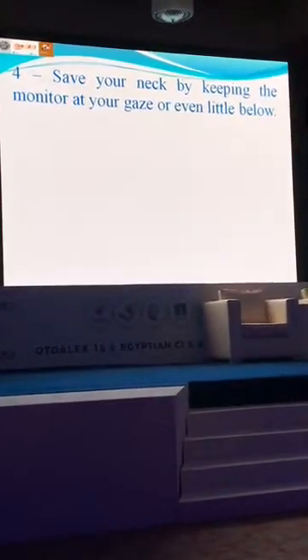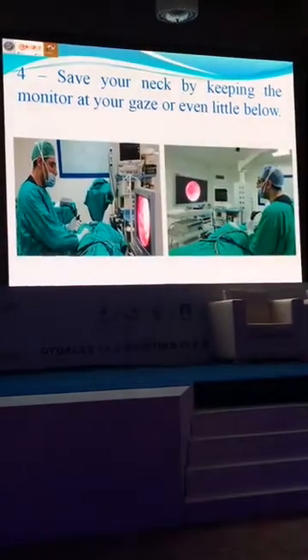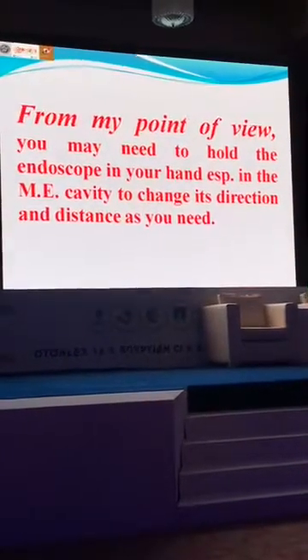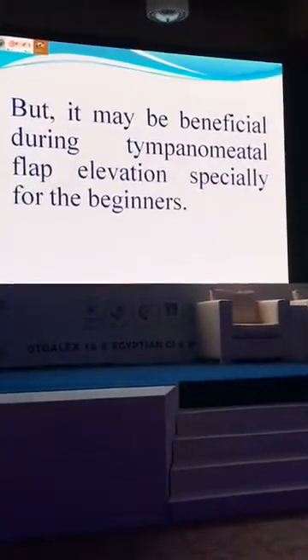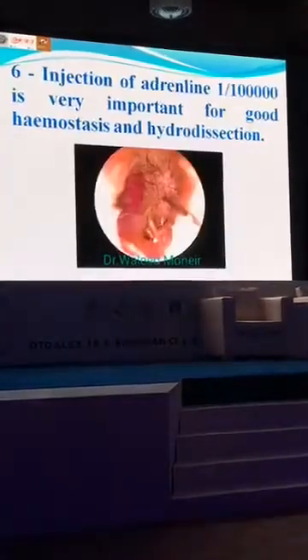Fourth, save your neck by keeping the monitor at your gaze level or even lower, whether you're working sitting or standing. Fifth, the endoscope holder. Is it beneficial or not? From my point of view, you may need to hold the endoscope in your hand, especially in the middle ear, to change its direction and distance as you need. But it may be beneficial during the tympanomeatal flap elevation, especially for the beginners.